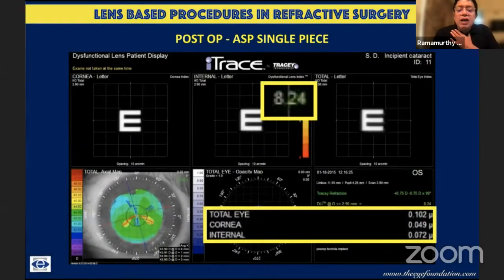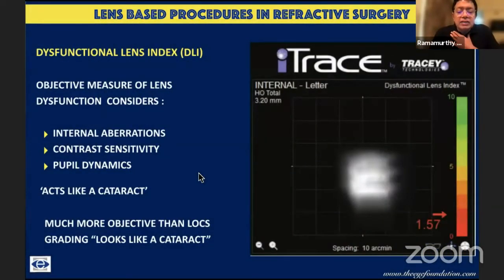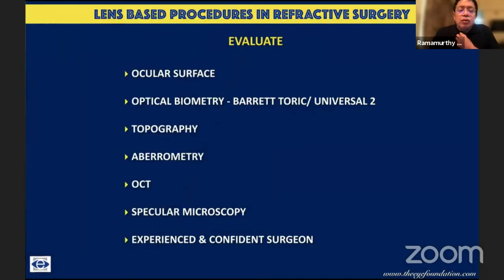On the other hand, if I have a patient like this, where the DLI is 8.24, and you can see the internal aberration is extremely small, this is the kind of patient who, if he or she wants a correction of the refractive error, I'll still do it on the cornea rather than take out the lens. So basically, the dysfunctional lens index gives an objective measurement of lens dysfunction, taking into consideration internal aberrations, contrast sensitivity, and pupil dynamics, where even though anatomically it doesn't appear like a cataract, the lens acts like a cataract, and the patient might benefit from taking it out.